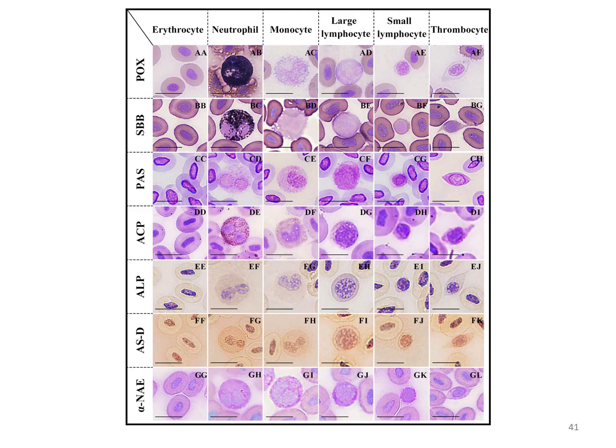It's similar to this one, except that you will be using different terms. For example, you will use color. What is the color for peroxidase? What is the color of the cytoplasm? For the erythrocytes, for the neutrophil, or the different types of cells. You can add here the myelocytic series, like the promyelocyte and all of them. So, description rather than color. It's more like this one.